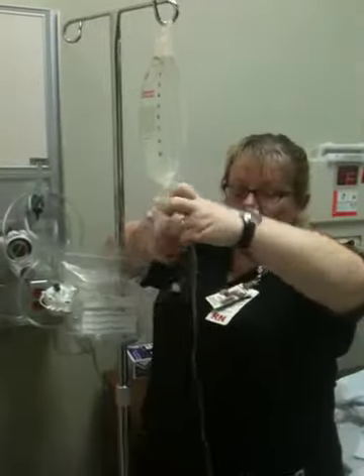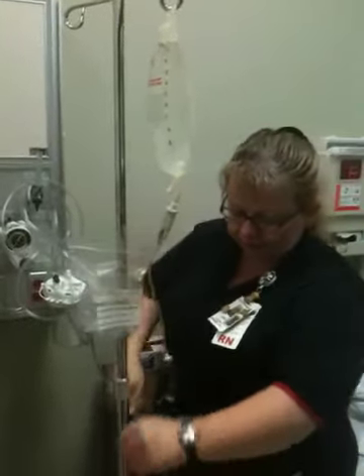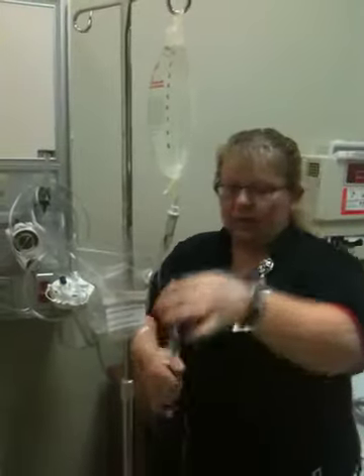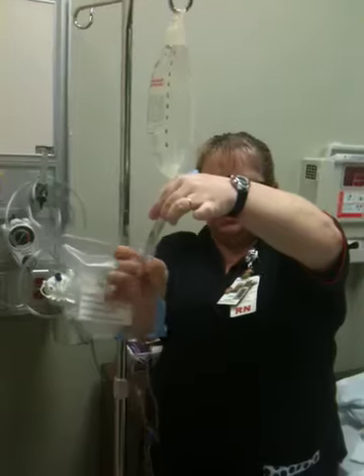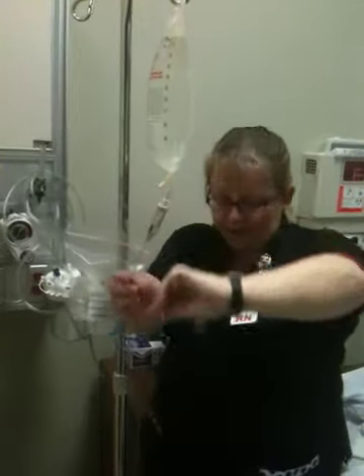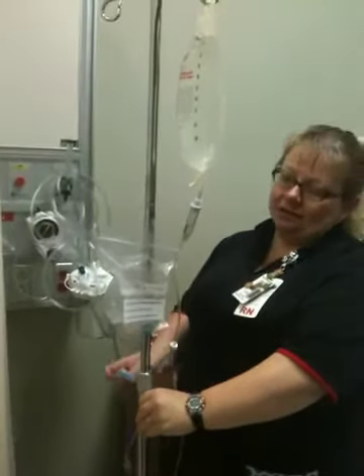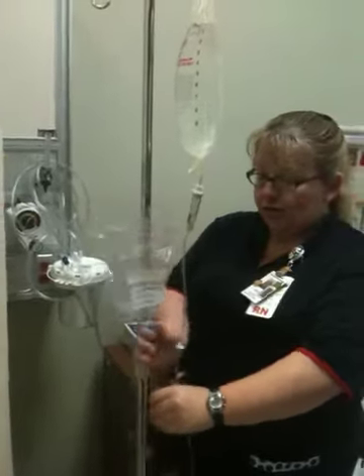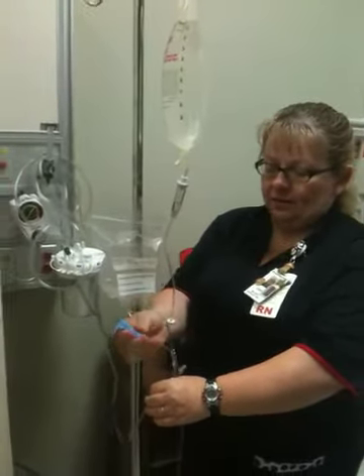You're going to see the air bubbles coming down. Again, flip it up — if you flick on this, you're going to see more air bubbles come out because it's holding a little bit of air. Get all your air out of it. Once the air is out and it's dripping, take your roller clamp, clamp it down, and you have primed your primary tubing.